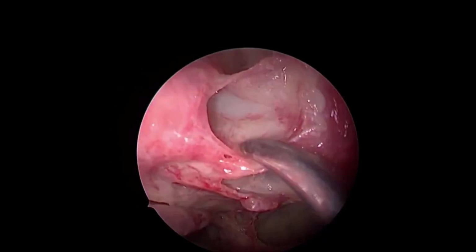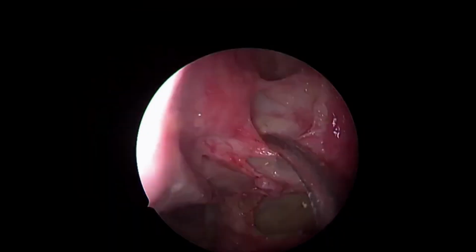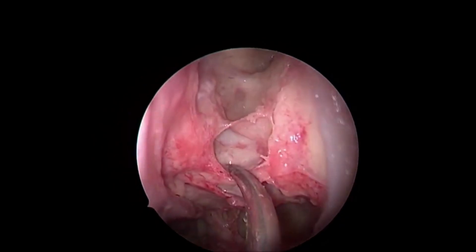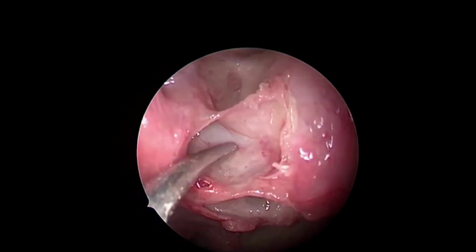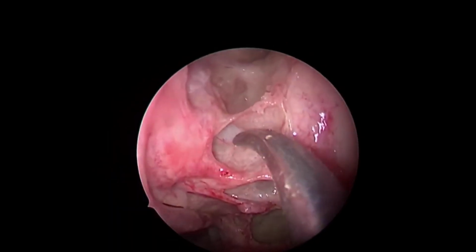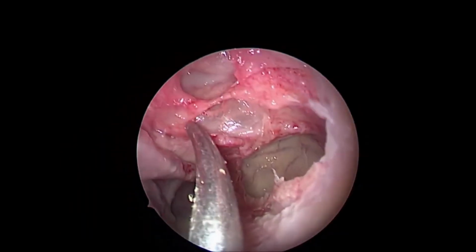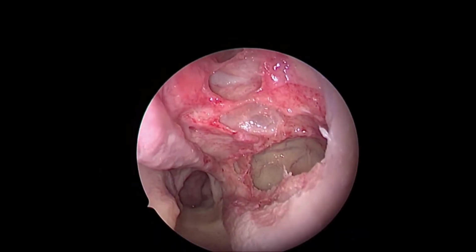If I keep doing post-ethmoidectomy, I may accidentally enter the sphenoid sinus if I am not very oriented, and in that situation I may damage the important neurovascular structures in the posterolateral wall. So my fear is, during this posterior work behind the ground lamella, I need to develop certain landmarks to prevent the possibility of complications.